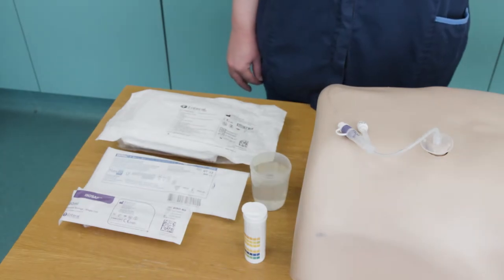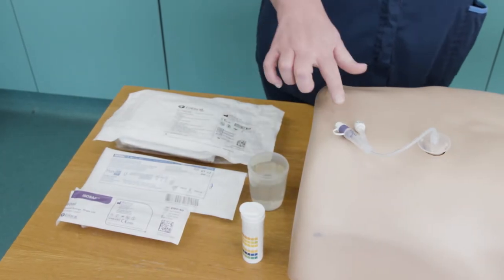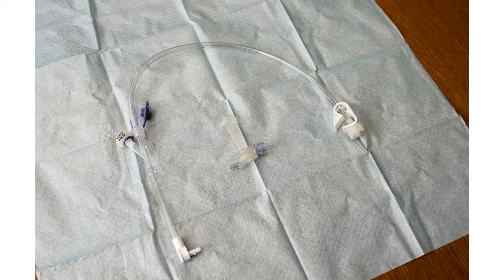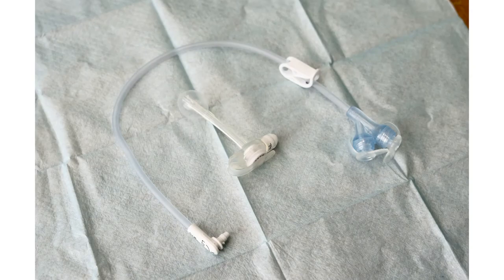This video will explain how to replace a balloon gastrostomy tube or button tube, i.e. a mini or mickey tube.